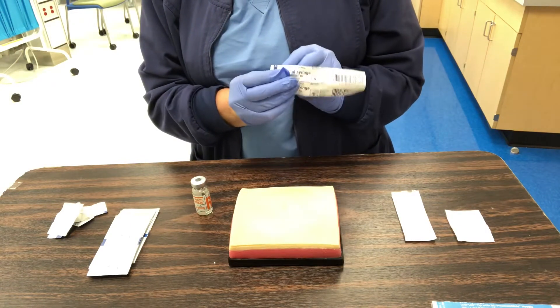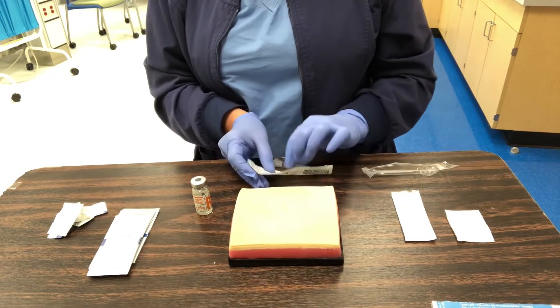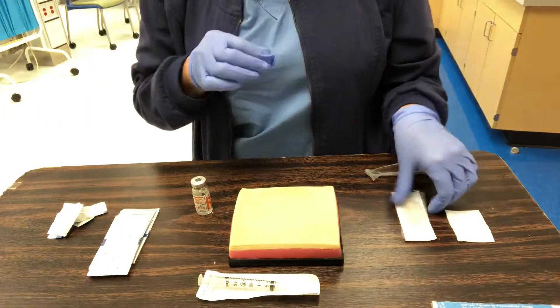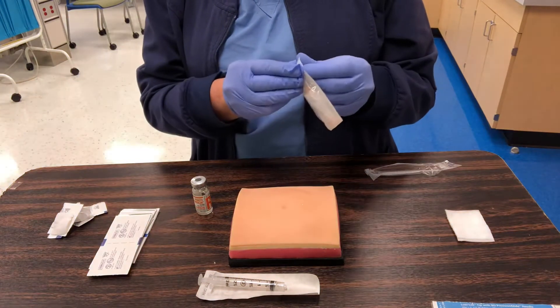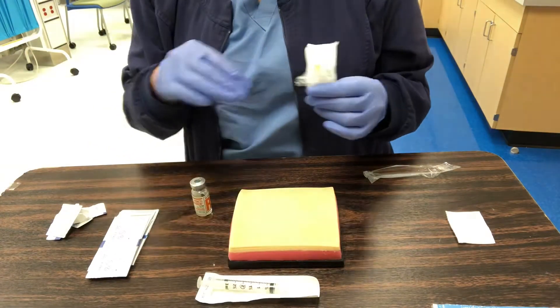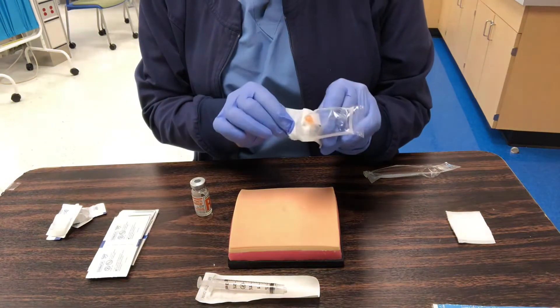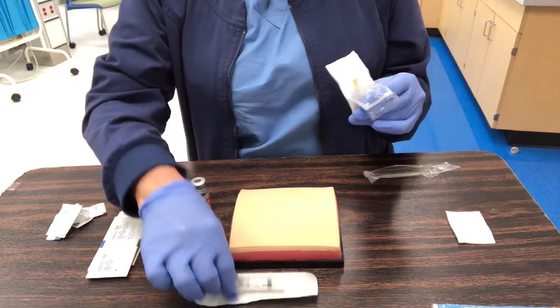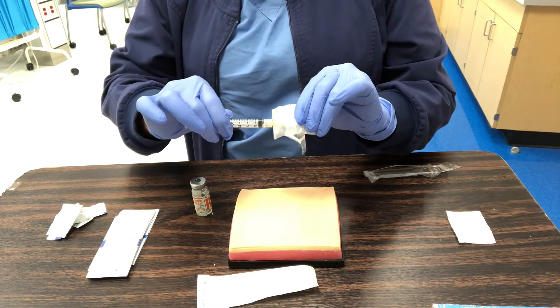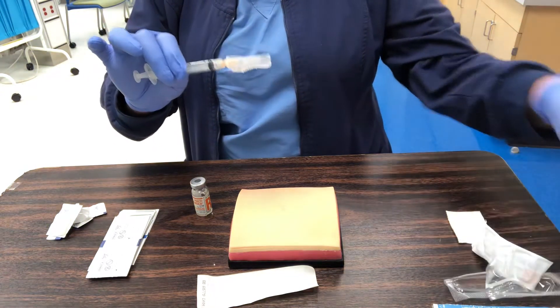I'm going to open my 3 mL syringe and keep it on its packaging so you can see. Then I'll open my needle, laying it on the packaging — the inside of the packaging was sterile and the tip hasn't touched anything. I've opened my needle, picked up my syringe, and this is a luer-lock type, so I'll gently screw the needle onto the syringe and remove the trash from my area.